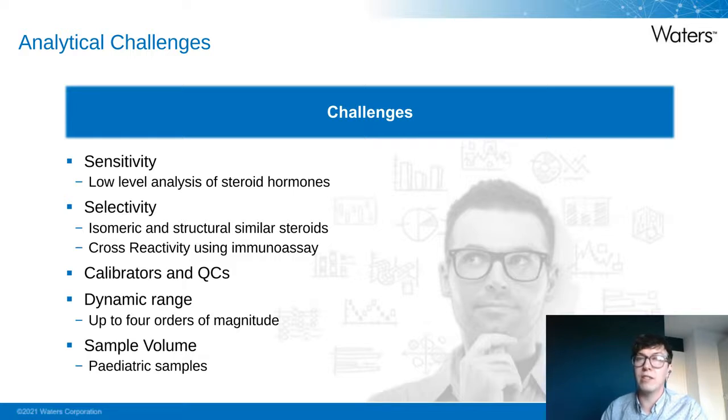Although not exclusive to steroid hormone analysis, the preparation of in-house calibrators and QCs can also be a challenge in terms of time and resource. The process in generating in-house calibrators that provide acceptable data for external quality assurance samples can take time. This can be particularly difficult with large numbers of steroids that can often be found in a single panel for analysis. In addition, demonstration of metrological traceability may be required to aid compliance with regulatory guidelines.